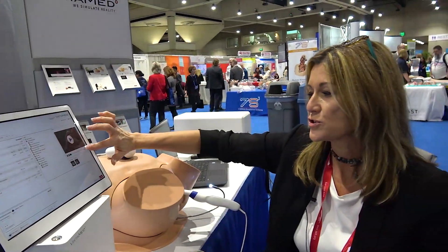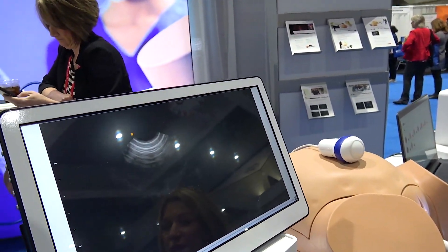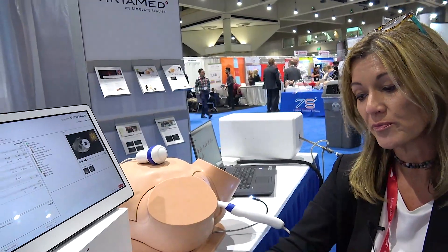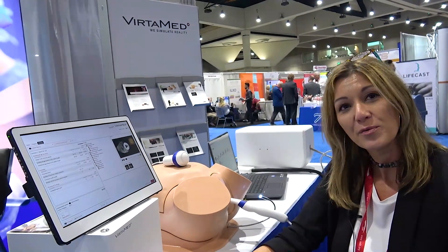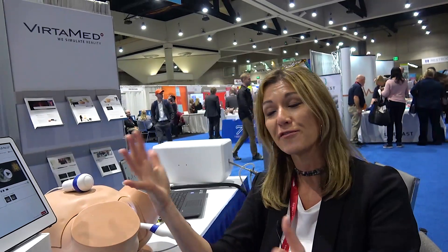This allows the instructor to go back at a later date and actually view a video recording of the scan. It also scores you, and your instructor can set courses for you that are basically customized for you — you have to pass with 85% before it will let you go into the next case. The instructors can really set the pace, and they have all of this access online. They can view reports from home and help customize training for each individual student on the areas they're struggling in, instead of focusing on areas they might already have mastered.